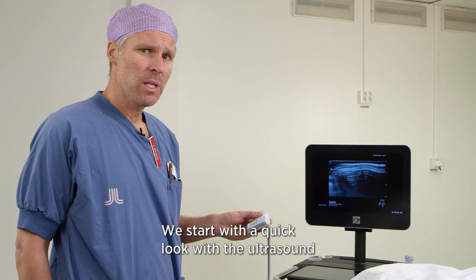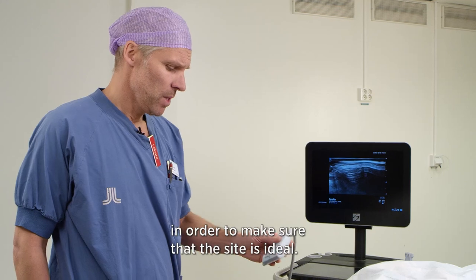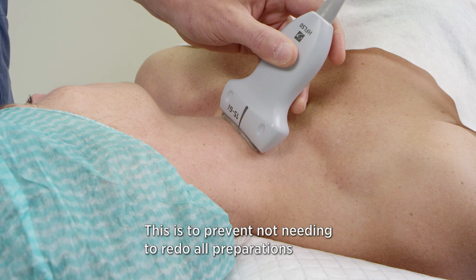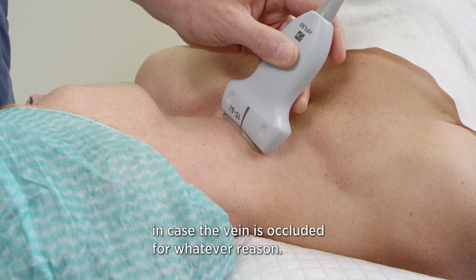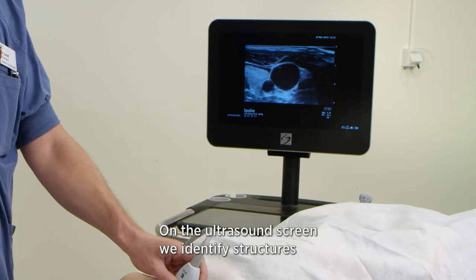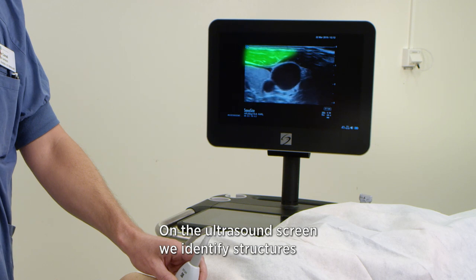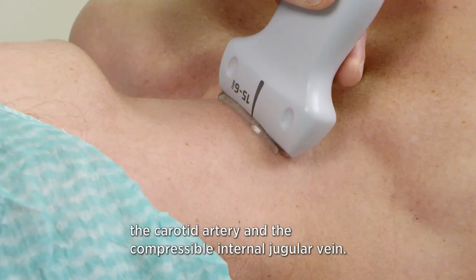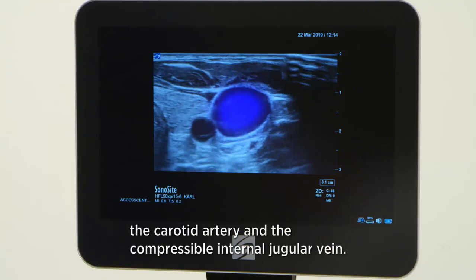We start with a quick look with the ultrasound to make sure that the site is ideal. This is to prevent needing to redo all preparations in case the vein is occluded for whatever reason. On the ultrasound screen we identify structures such as the sternocleidomastoid muscle, the carotid artery, and the compressible internal jugular vein.